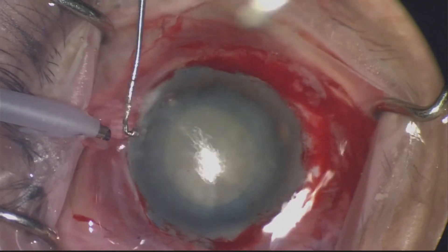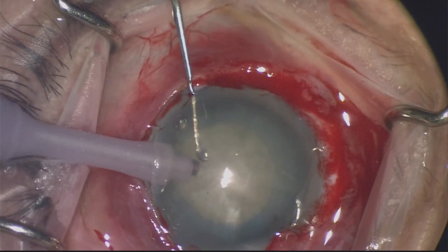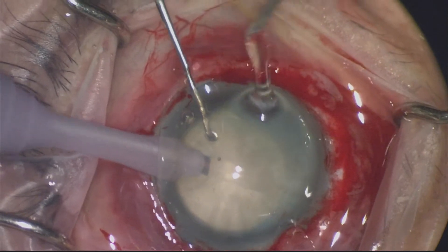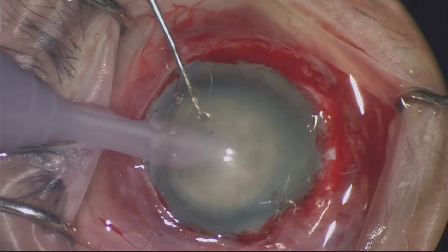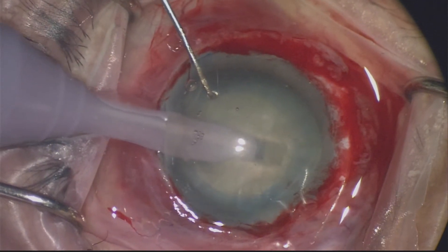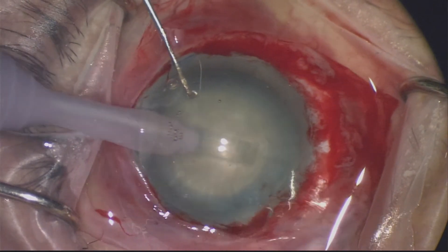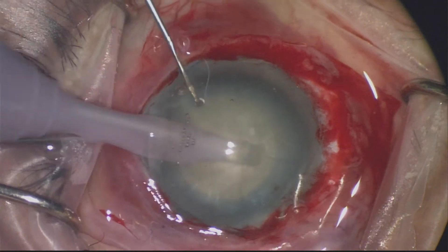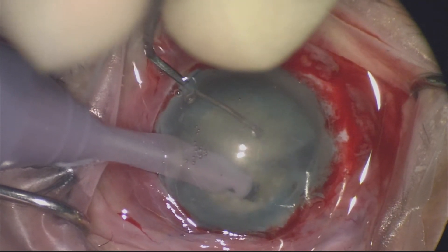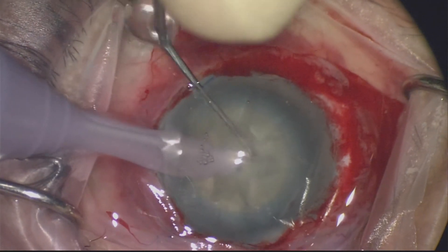Then I start gentle phaco. In this case you want the bottle height as you normally would — there's no need to increase it. I stick with what I'm familiar with and don't attempt a primary chop in an eye with a potentially difficult view. I always top up with HPMC and just use a divide and conquer technique. You assess the behaviour of the cataract — this one is midway, not overly soft but not excessively hard. I also check for excessive movement in the capsule to assess capsular support. The lens seems to break up quite nicely, and divide and conquer remains a safe fallback technique.